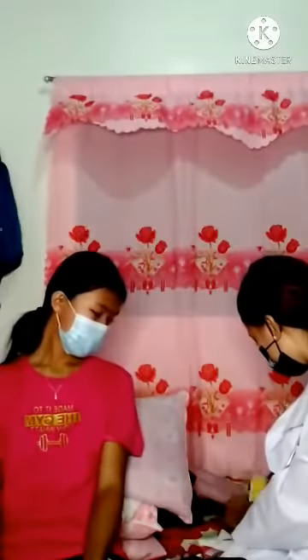And then after this, I will note the client record. And this is the end of the assessing of axillary temperature.